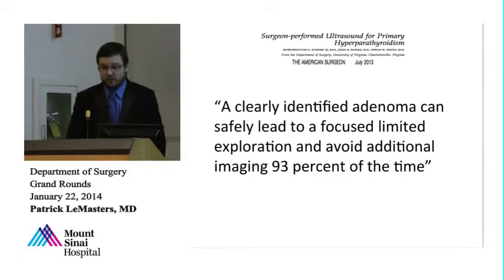This is another study of 200 patients with hyperparathyroidism that underwent surgeon-performed ultrasound imaging in the office. And based upon their findings, a clearly identified adenoma in the office can lead to a focused, limited exploration and avoid further imaging 93% of the time.